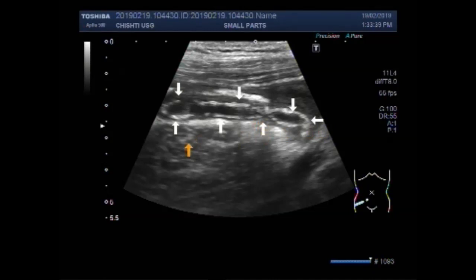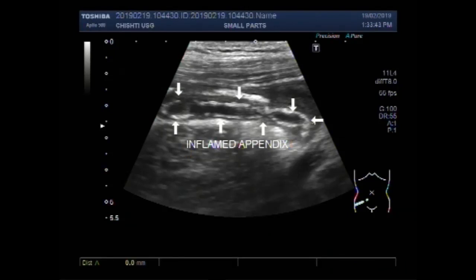This is the whole length of the inflamed appendix. Now you can see the measurement of the appendix. It measures about 52.2 mm x 5.5 mm.